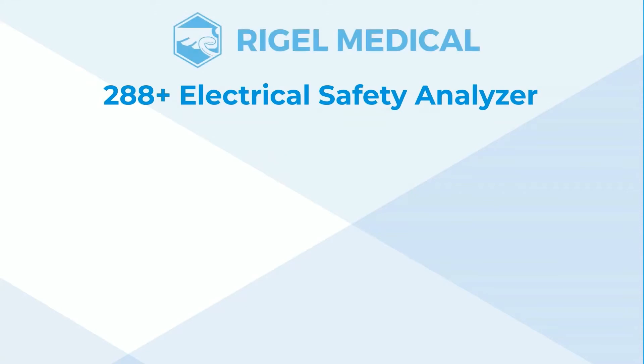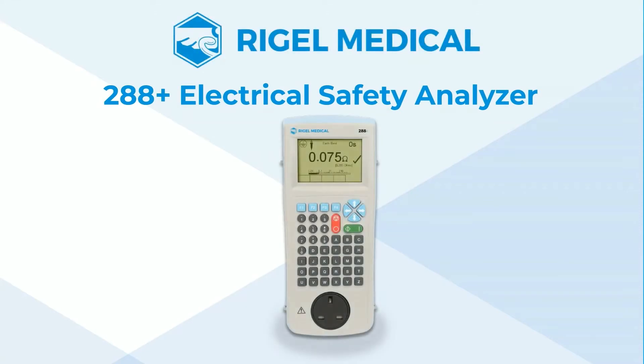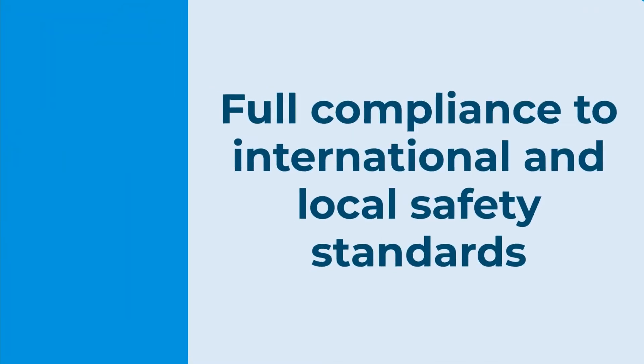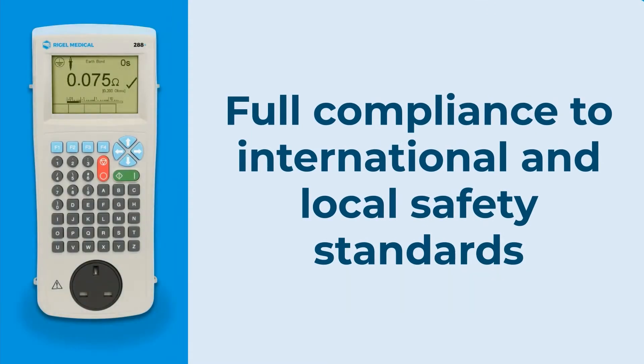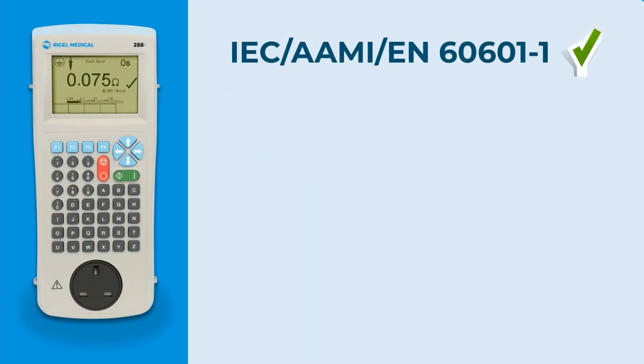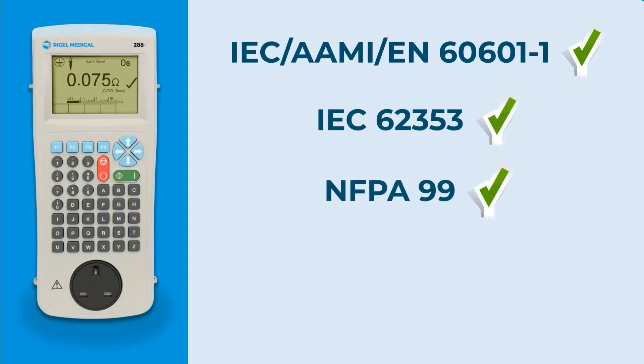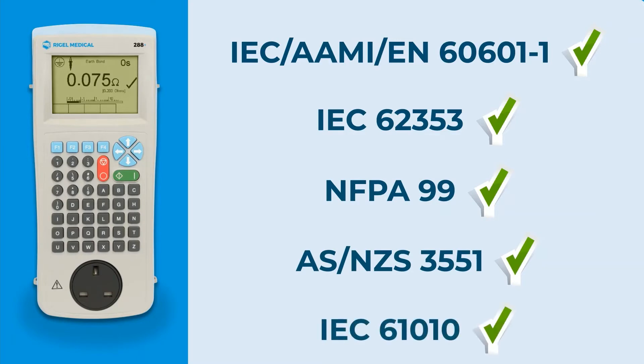The 288 Plus Electrical Safety Analyzer from Rigel Medical, full compliance with all the major safety standards including IEC 60601, 62353 and NFPA99.